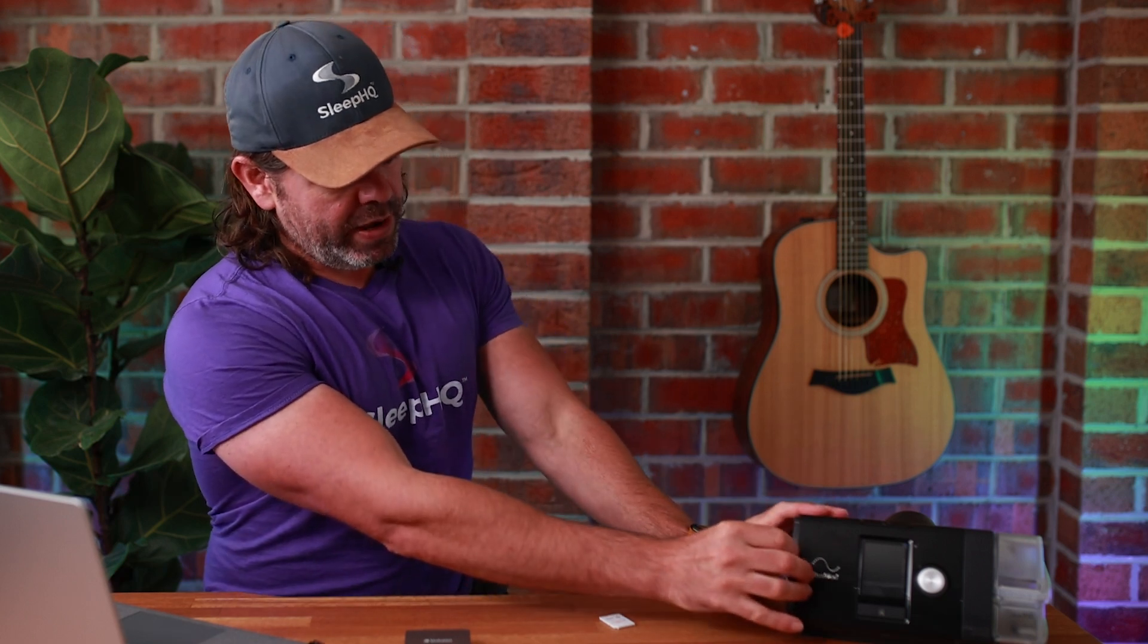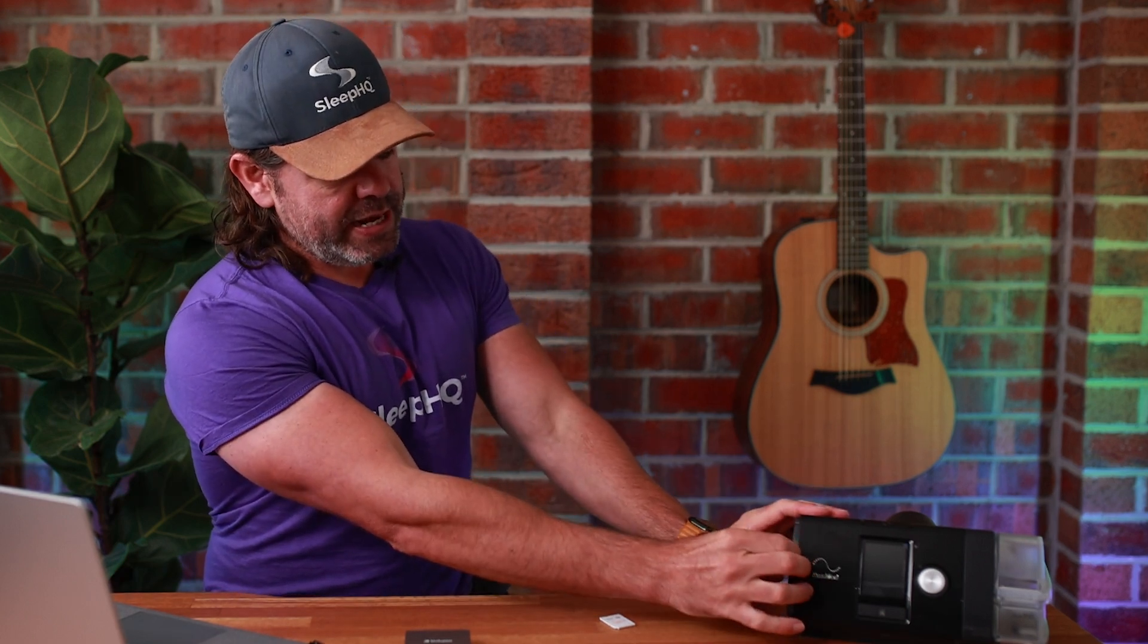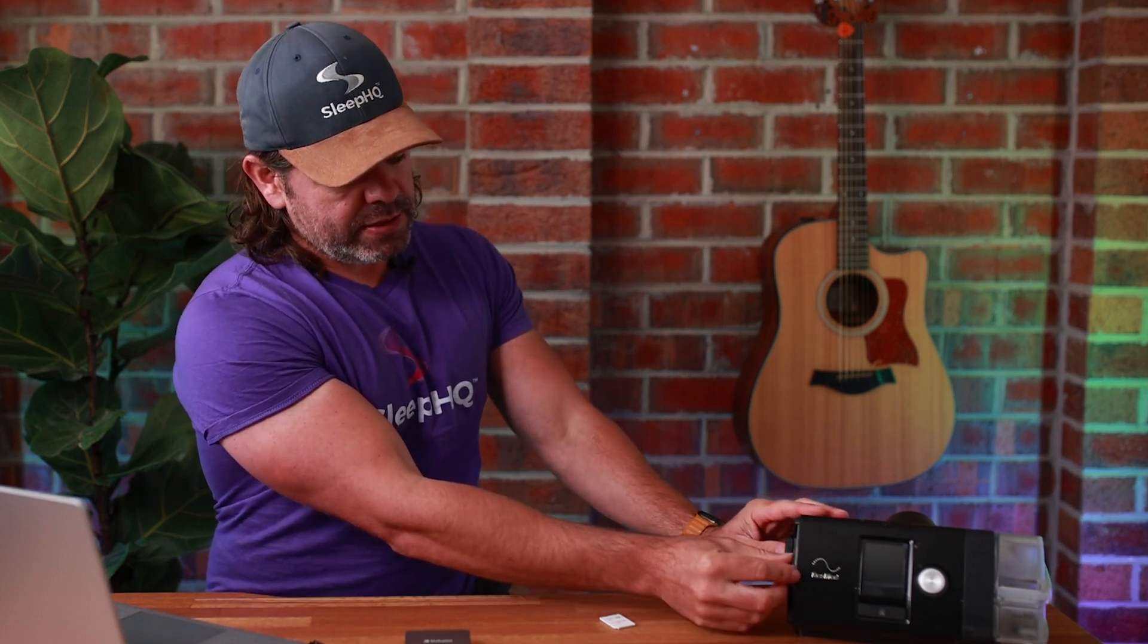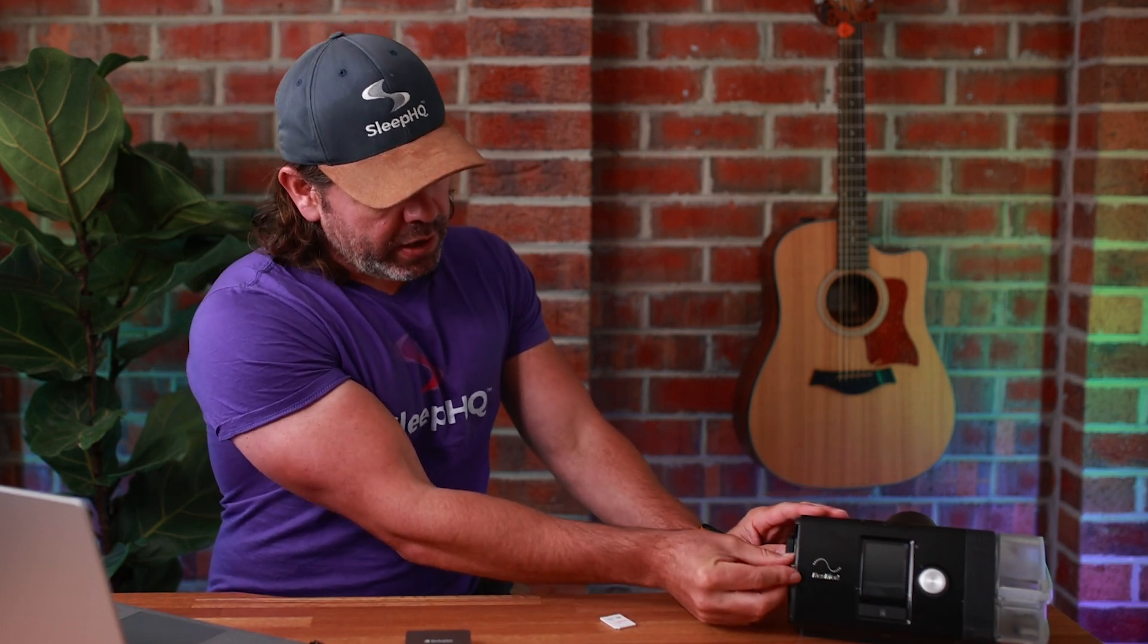Okay, step number one, we need to remove our SD card from our CPAP machine and somehow connect it to our PC or laptop. Now, here's my AirSense 10. The SD card is located in the side. I just press it in, pull out the SD card.